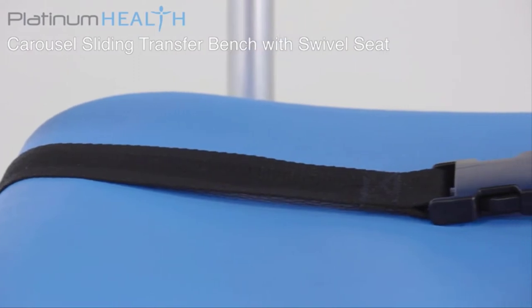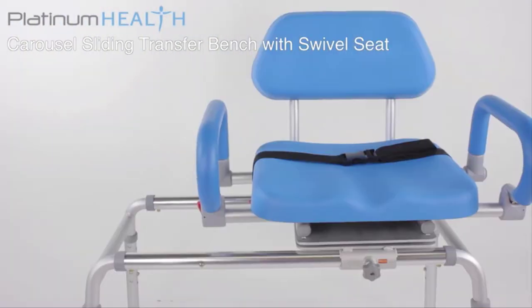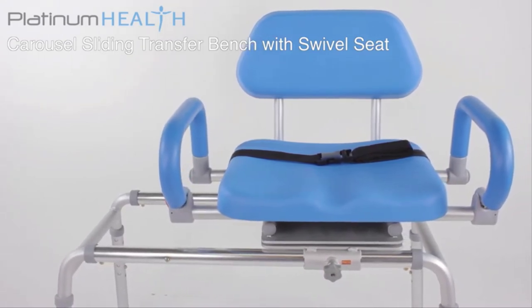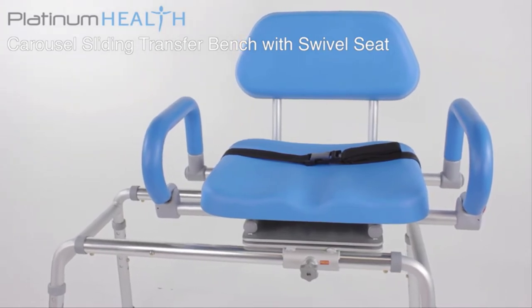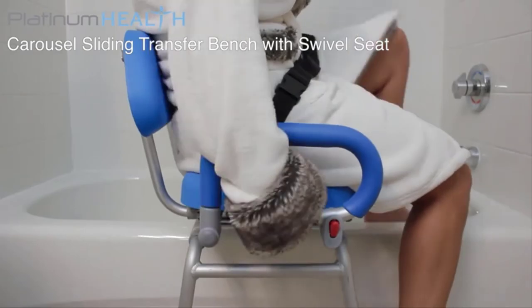An integrated safety belt prevents users from sliding forward. The padded seat base and backrests provide users with a warm, soft surface for long-term seated comfort, eliminating the need for bathing to be rushed. Once seated, the chair can be effortlessly rotated and slid into position for bathing.